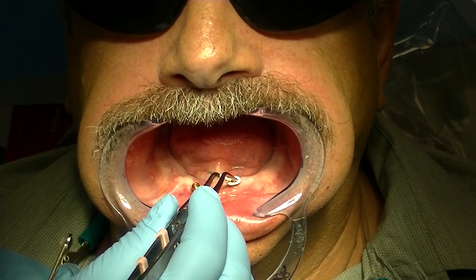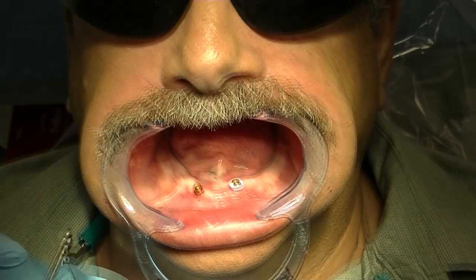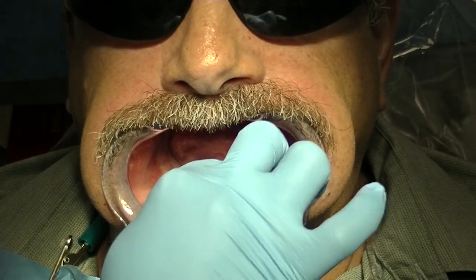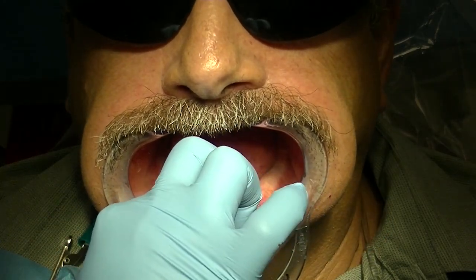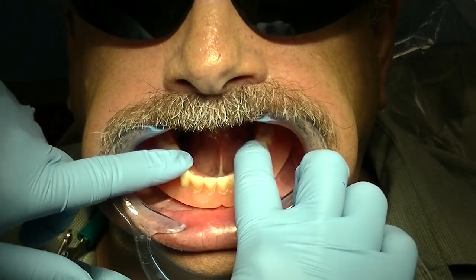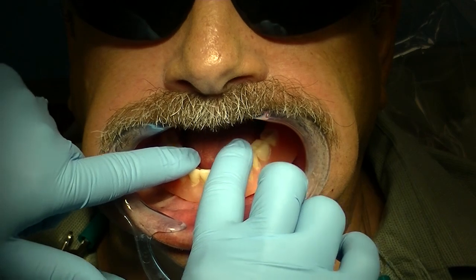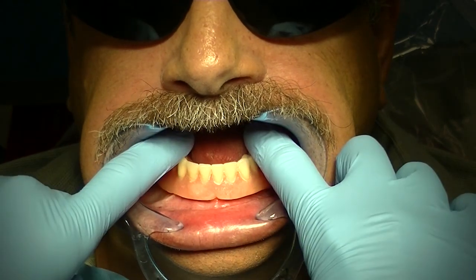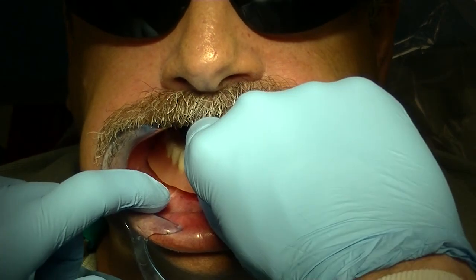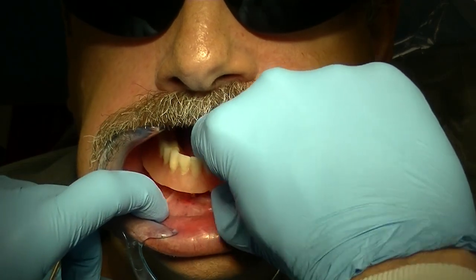At this point, what we're doing is putting on the processing o-ring spacer. This is just going to be snapped lightly on top of the locator attachment. We place the denture cap on top of that. If we place the denture with an initial relief chamber or relief hole on top of the denture cap, we're verifying if we have any contact. I like to do one at a time — I just find it easier to manage rather than trying to do both at the same time.